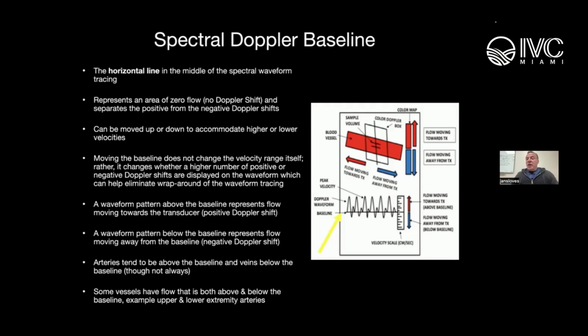And this often happens where the manufacturer has this set fast or medium in terms of the speed. And what happens is that you encounter reflux and it's going too fast, so you're not able to depict the entire length of the reflux.